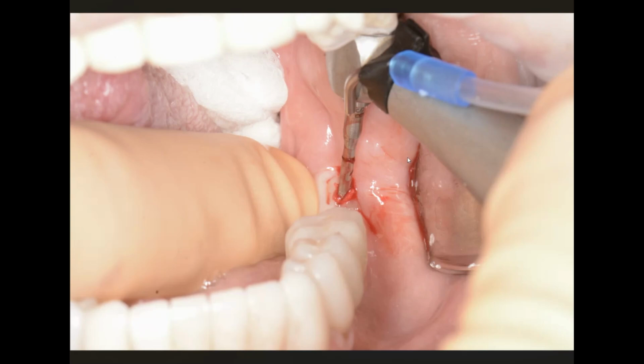But for the purposes of this experiment, I wanted to show you an in vivo study on what you get if you do both techniques at the same time. The patient knew we were going to do this, and fully consented at the beginning. So here we are using our osteotomy burr, going into the number 18, 17 area, and we're just penetrating through the superior cortex. I'm not drilling this far down into there.